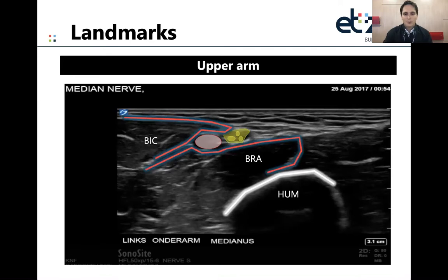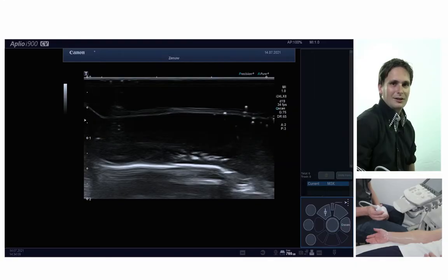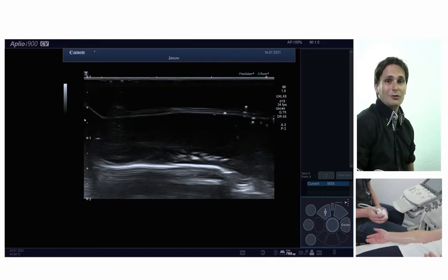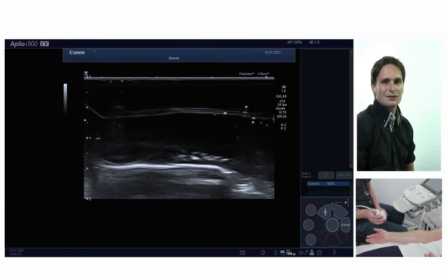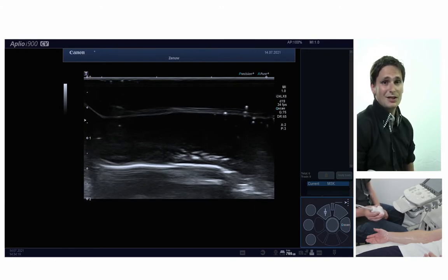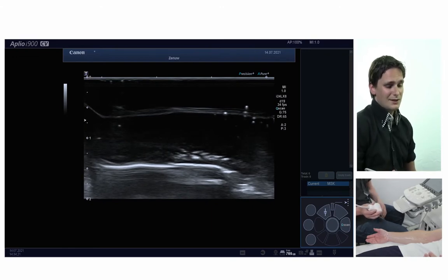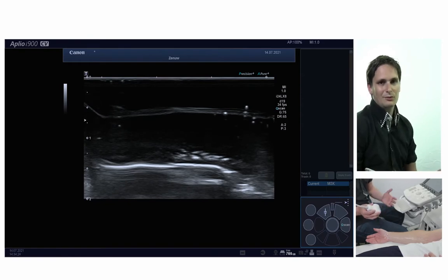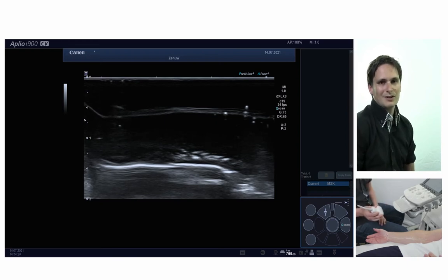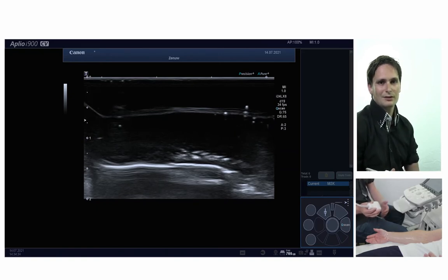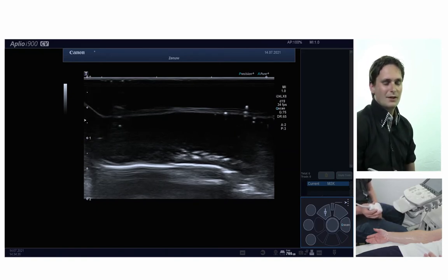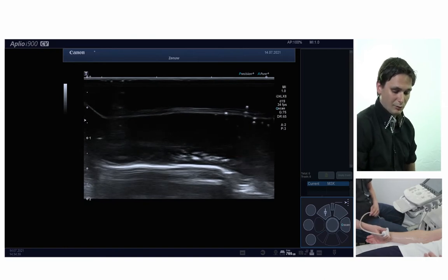Now we'll go to the live demonstration of the median nerve. I will perform a live demonstration of how to scan the median nerve with ultrasound. There are different ways to position the patient. In this case I positioned the patient supine because I also want to visualize the median nerve in the upper arm. If you only want to perform investigation for carpal tunnel syndrome, the patient could sit and just lay their arm down.